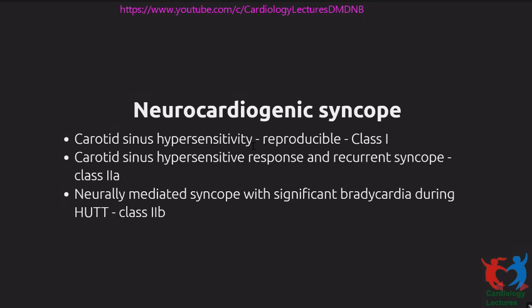Now, if you leave out carotid sinus syncope and come to the usual vasovagal syncope, or what is called neurocardiogenic syncope, it's still a 2B indication by guidelines. And only when you have a heart rate reproducing symptoms, showing it to be a typical cardio-inhibitory type, where sinus bradycardia and not hypotension is the dominant cause of the syncope. In that case, pacing might help these patients. And typically in these cases, you have to pace with a dual chamber pacemaker, ideally with a device which has a rate drop response.